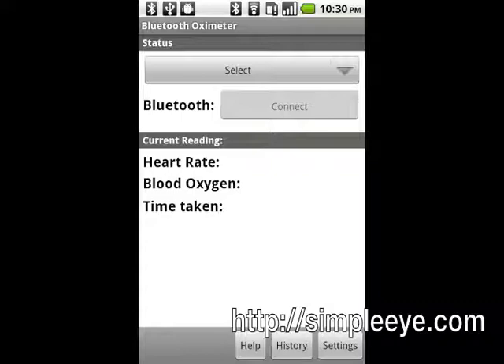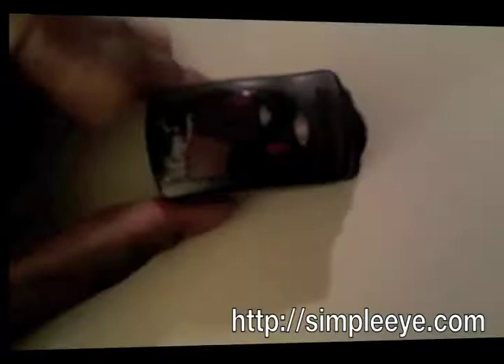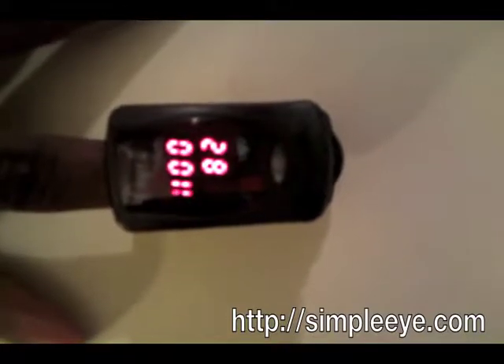You will now need to pair your Android device with your pulse oximeter if it is not already paired. Put your finger into your Nonin Bluetooth pulse oximeter to activate it. Wait until the indicator light on the front is flashing green.